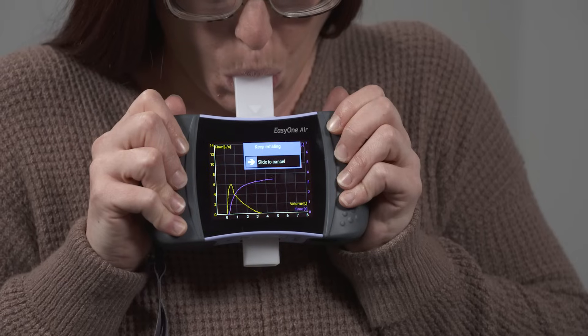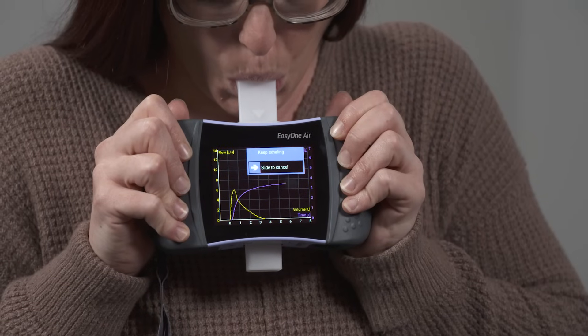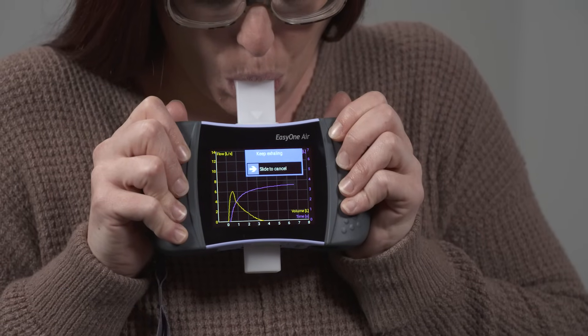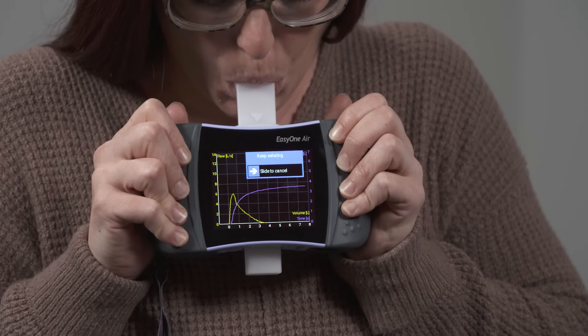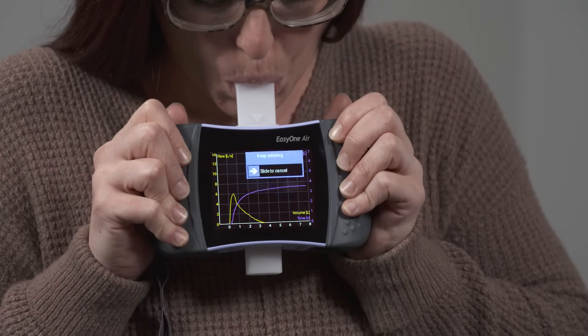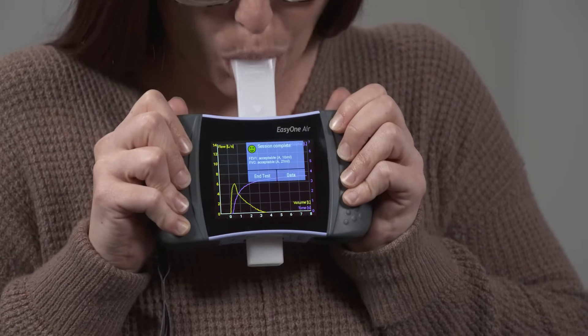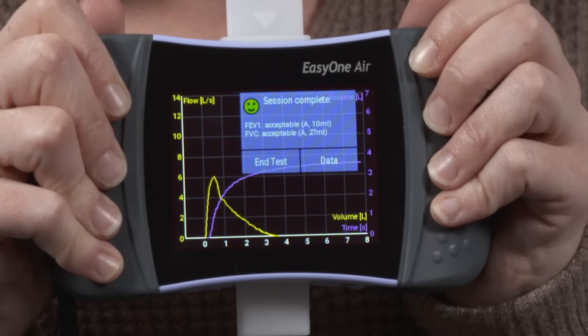Once your test session is complete, you can view the results. Session quality grades for FVC and FEV1 will be displayed along with your results.